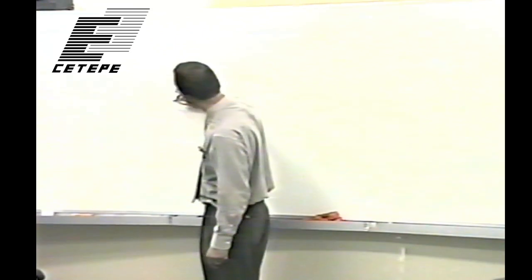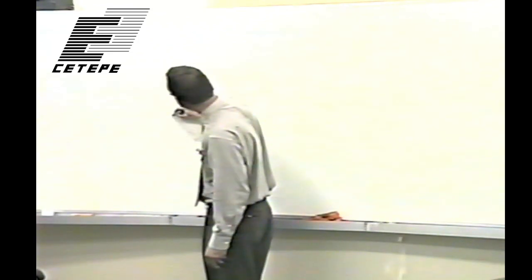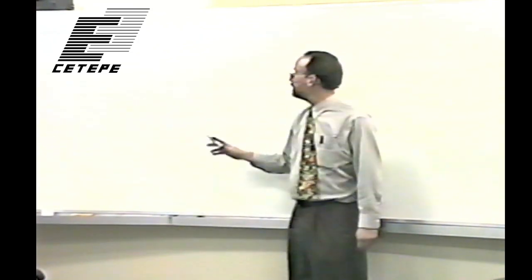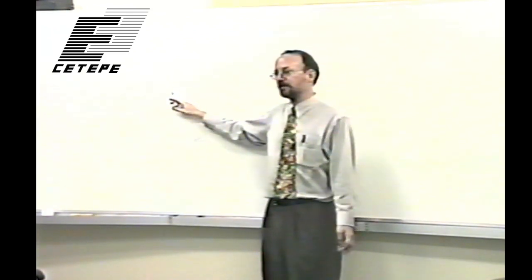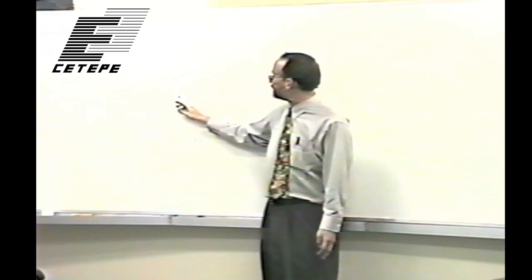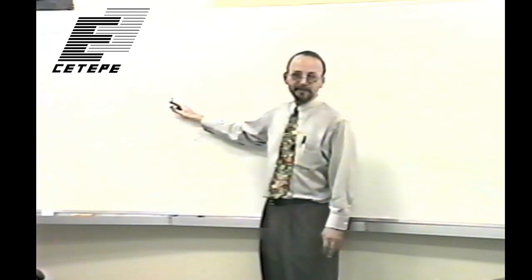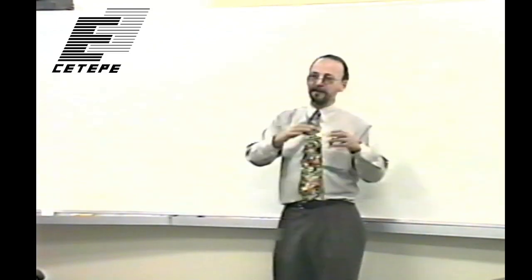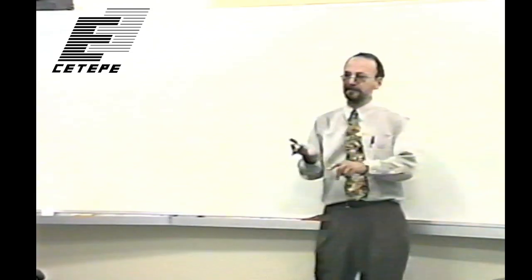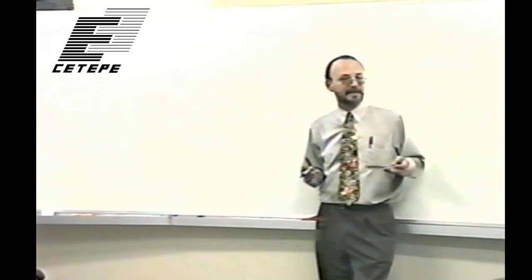And then if we were able to take a second image without the patient moving, just below, again with a monochromatic source, but just on the other side of the K edge, we'd have maybe a 100-fold less likelihood of an interaction. So in this image, the iodine vessels would absorb very strongly, and in this image, they would absorb much less strongly. But because these energies are so close, all the other tissues in the body, including bone and liver and all the other things that had no iodine, would absorb almost exactly the same, right?